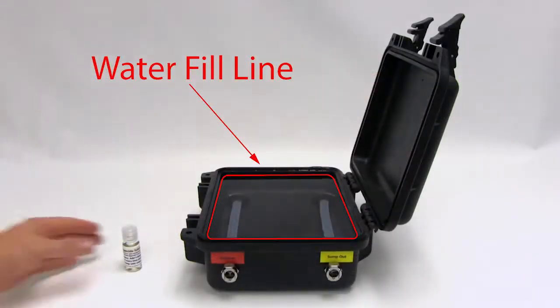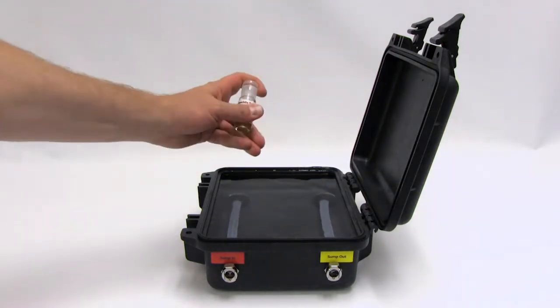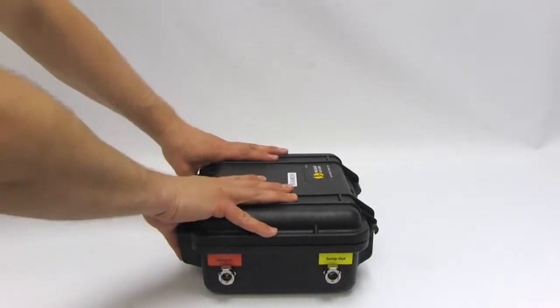Fill the sump with water to its fill line. Every time you fill the sump, add four drops of algaecide solution to the water. Close and secure the sump lid. Place the sump on the floor.